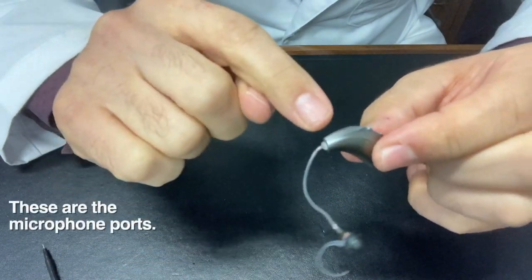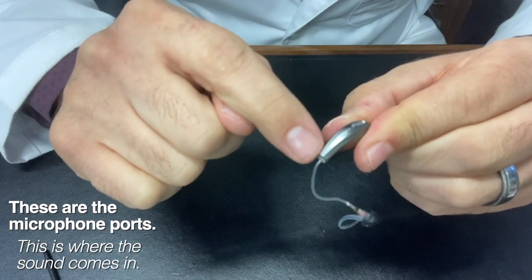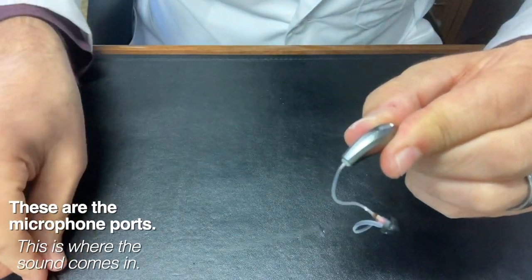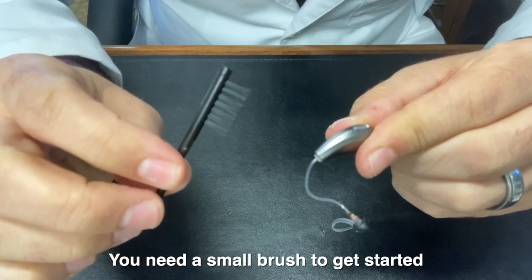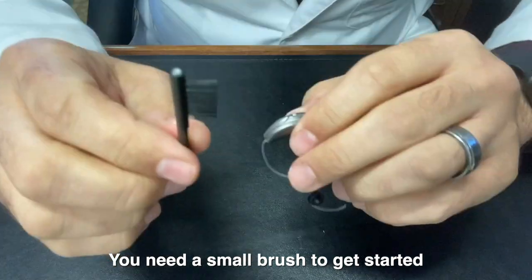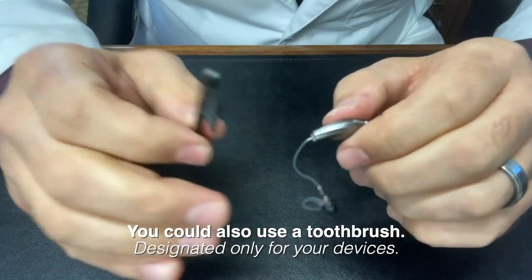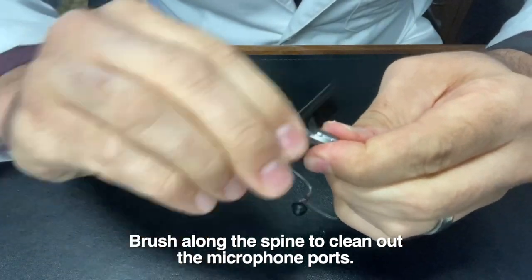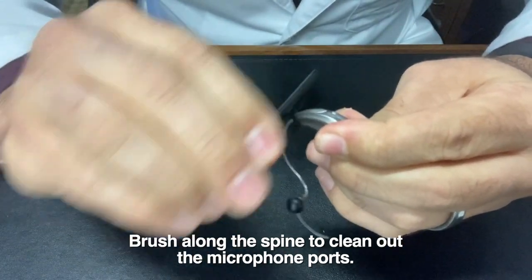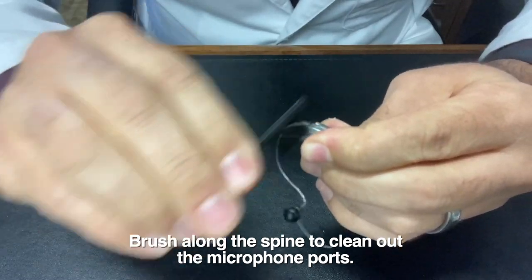The first thing I like to do is brush out the microphone ports. The microphones are actually underneath the spine here. If you take a little brush — you may have been given one with your devices, or if not, you can just buy a cheap toothbrush that you use only for your devices — and just brush along the spine a little bit to clear away any debris that may be in those microphone ports.